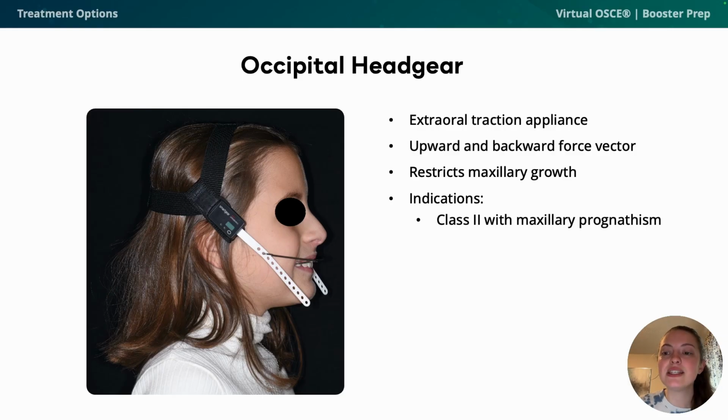And this means that this is designed to treat patients with an open bite tendency rather than a deep bite. This also means it's beneficial for patients with an increased lower facial height, as intruding the maxillary molars will deepen the bite and therefore decrease the lower face height.